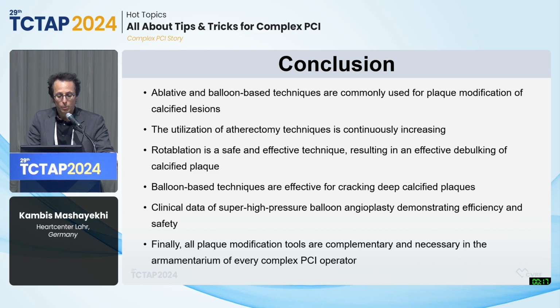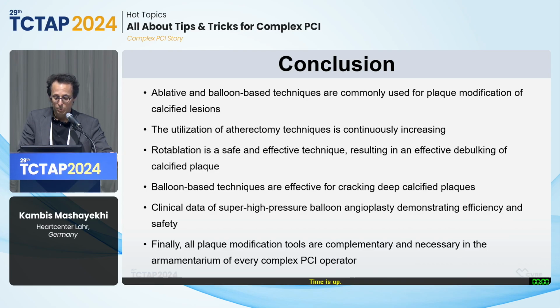The clinical data of super high pressure balloon angioplasty demonstrate efficiency and safety as long as you use it in concentric calcified lesions. Finally, plaque modification tools, as I said, are complementary and necessary in the armamentarium of every complex PCI operator.